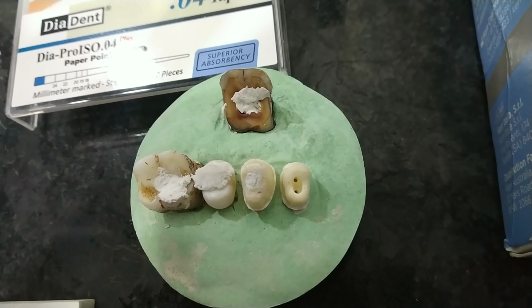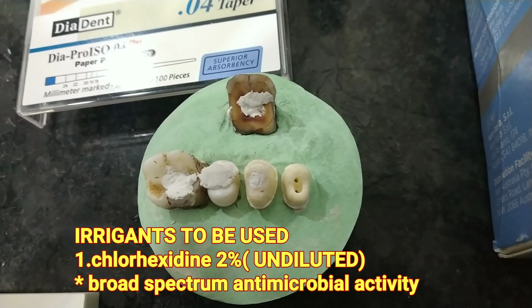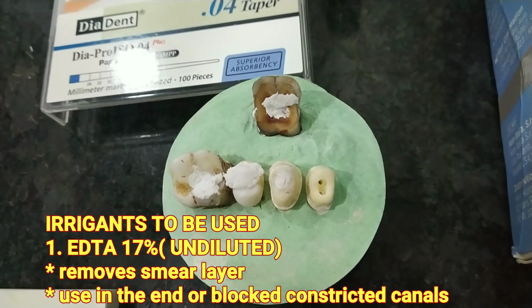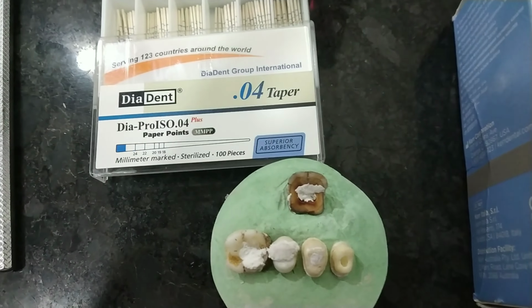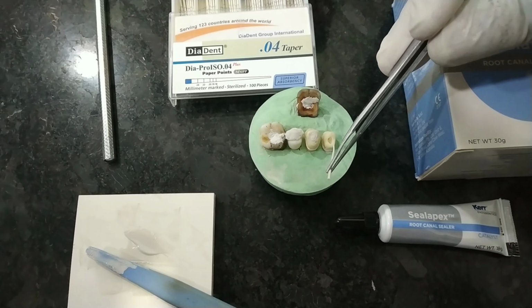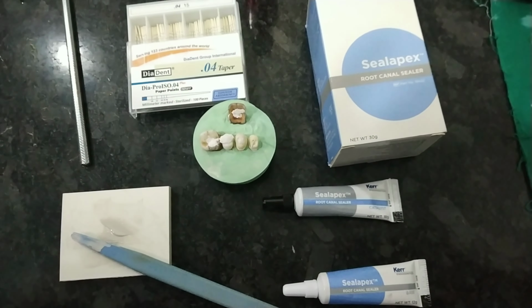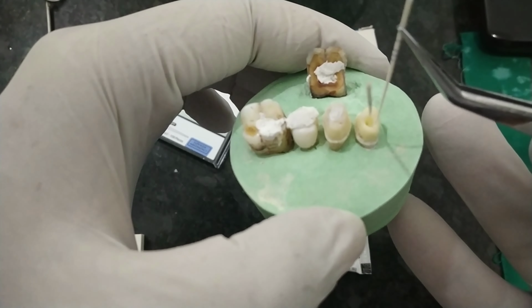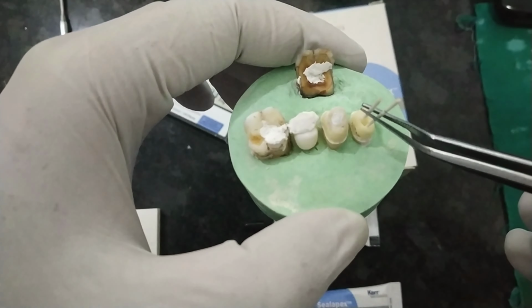So we have already done the BMP of the premolar tooth, and now we are going to seal it with gutta percha. So after proper irrigation with 5% sodium hypochlorite solution, we have to do it EDTA solution so that all the dentinal tubules open, and after that we have to insert 2 paper points so that all the canals become dry. So this is the way we have to insert it in the canal. So this is the way. So we have to keep it for some time so that the canals become dry.